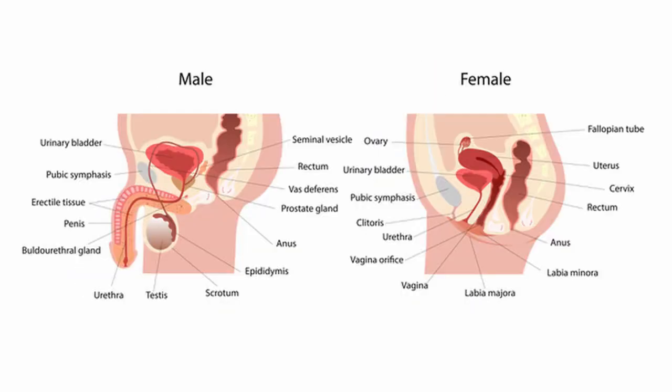Of course, we're only touching on the topic of cardiology and the potential to use ultrasound in point-of-care ultrasound. We need to move on though. We need to move on to another cavity. Let's take a look at the Douglas or Bruce cavity, so the lower abdomen. Let's see how this is done in a demo.